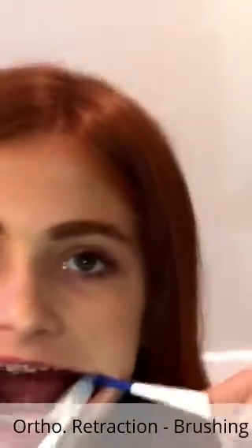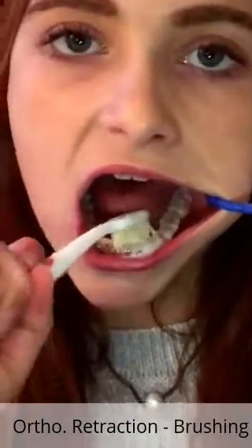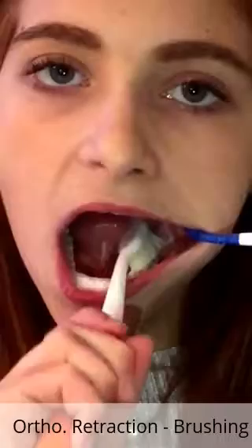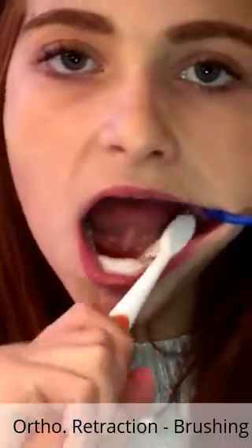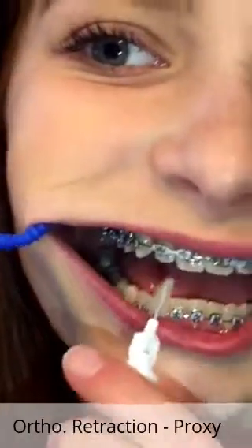You can see now how she is fanning out and retracting that cheek with the mouth mate tool, so she can really get to the buccal and lingual side of those back molars really nicely. That's where a lot of the bacteria collect, so we really want to get that plaque away.